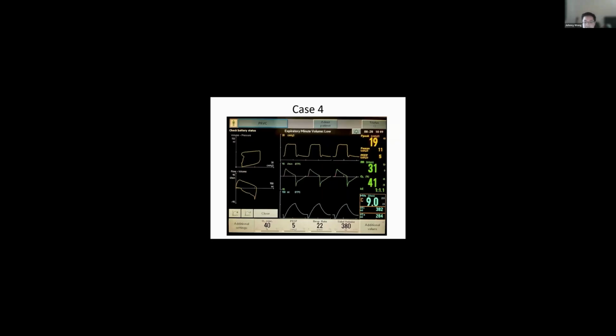Now the patient is a trach-to-vent patient, brought in by family because the alarms are going off. We take a look at the monitor. Anybody notice anything on this monitor that may be causing it to go off? If I could direct your attention to the bottom right corner, or on top, it actually writes it out. You'll see in the bottom right the volume inspirations, like 382. Yeah, good job, Sagar.